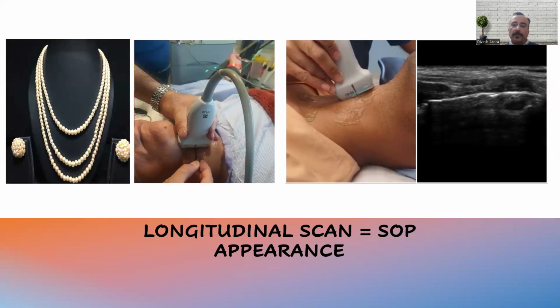Some of the anesthesiologists use an analogy that for a low ejection fraction patient, for example 20-25%, you secure the radial artery prophylactically. So why not, if you're dealing with a difficult airway, even if you have the best of gadgets in the form of a video laryngoscope or fiber optic scope, why not mark it? And if you are able to secure your tube with the help of a fiber optic scope, it's well and good. God forbid if you need to, then the marking is there and it will help you in doing the cricothyroidotomy very quickly.